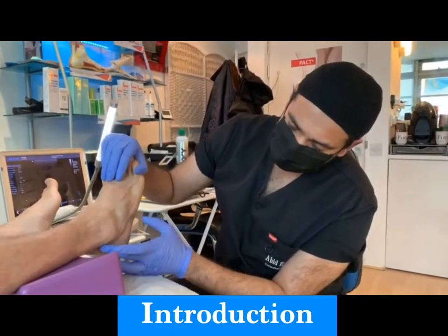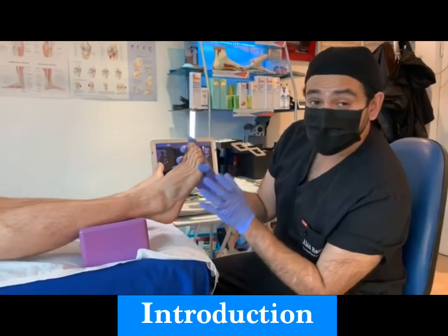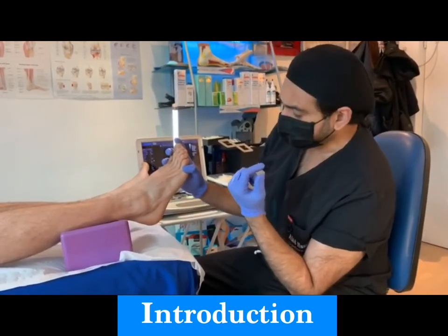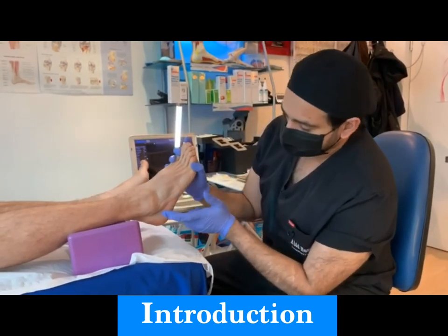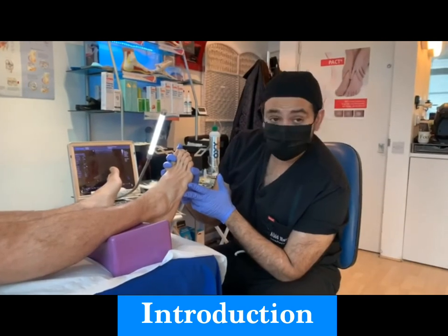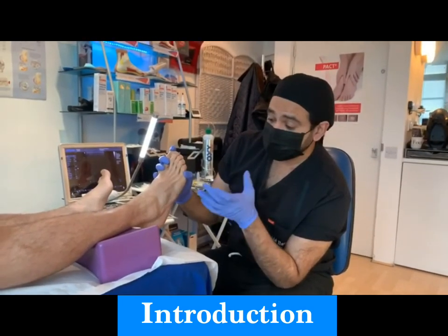Most people with peroneus longus tendinopathy get pain around here. This gentleman is one of the rare patients getting it where it shoots under the foot and just as it's going under the cuboid. There are a couple of other things that can occur here: you can get an accessory peroneal muscle called the peroneus quartus, which he doesn't have — the MRI confirmed that. You can also have an ossicle, a small floating piece of bone that can cause pain, but the MRI confirmed he doesn't have that either. What he does have is quite a bit of tendinopathy. He's an avid runner — he was running mountains and hills with a backpack. This typically happens with overuse. The enlarged peroneal tubercle means he was at risk of stenosing tenosynovitis anyway.